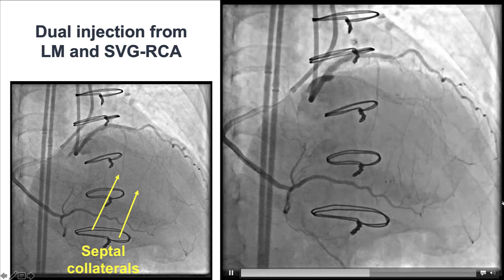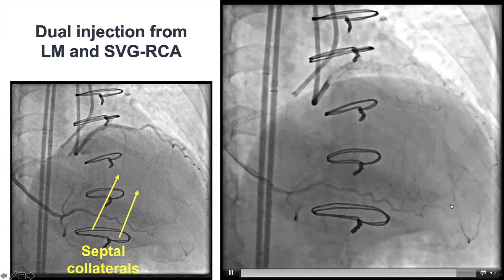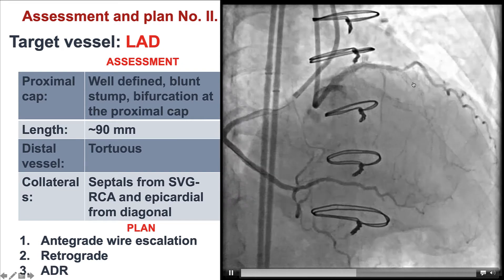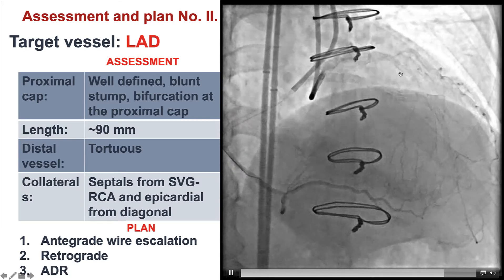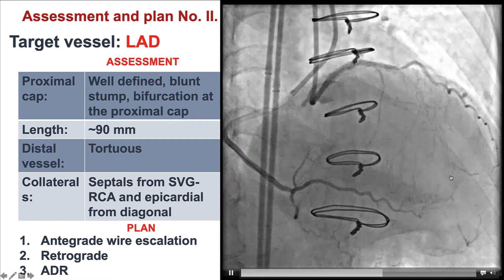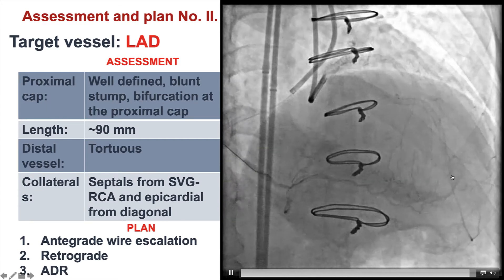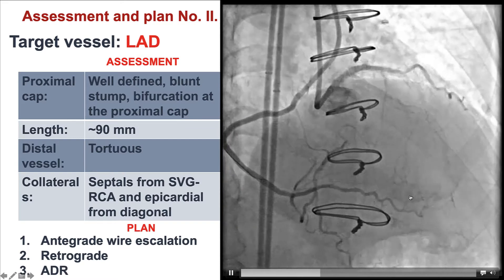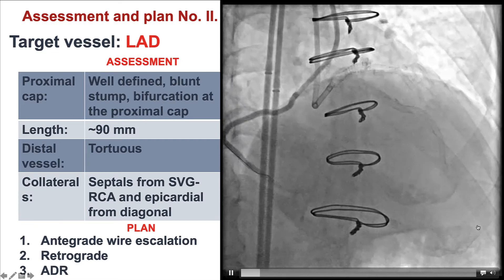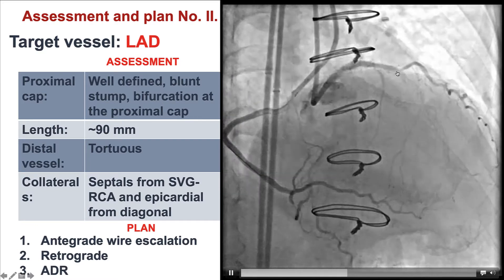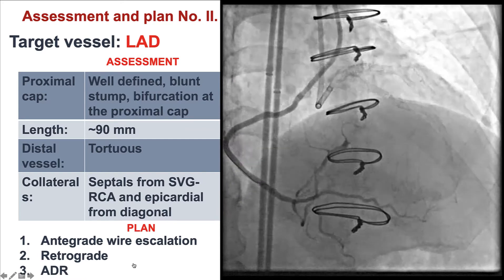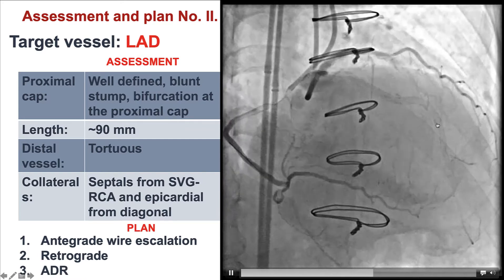There was also an epicardial collateral coming from the patent diagonal to the distal LAD. Based on the most recent angiogram, we had a CTO of the mid-LAD right after the takeoff of the large diagonal branch with a blunt stump. The occlusion length was long, the distal vessel was small and diffusely diseased, filling through collaterals from the right coronary artery via septal collaterals and an epicardial collateral from the diagonal. Our plan was to try antegrade wire escalation given the previous stents, then go retrograde, leaving ADR as a last option given the multiple previous stents in the LAD.